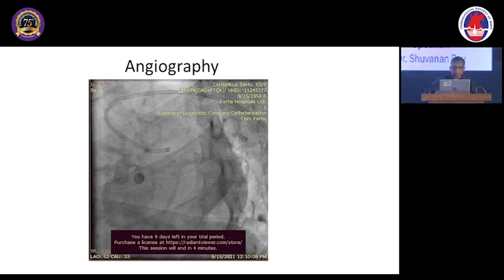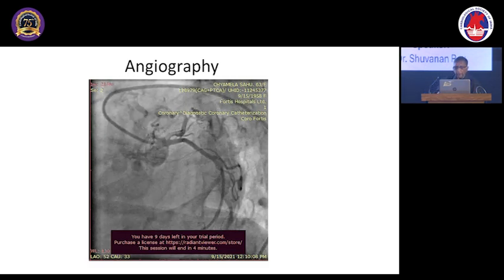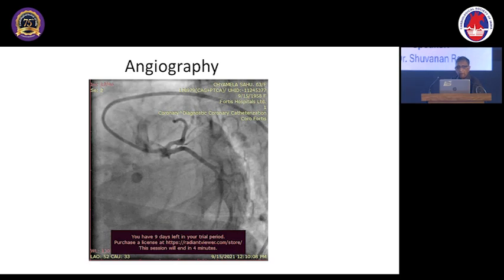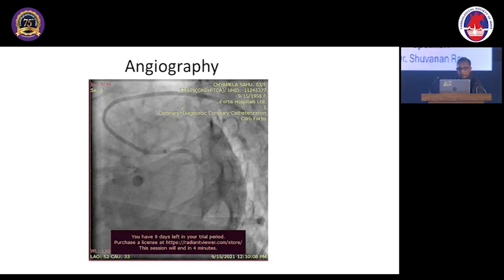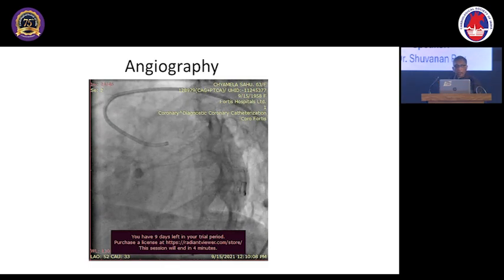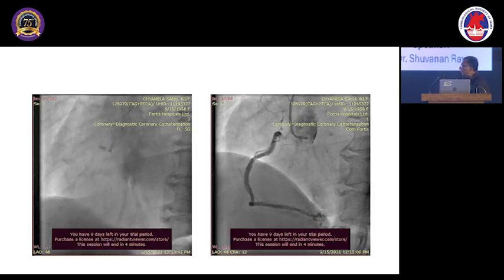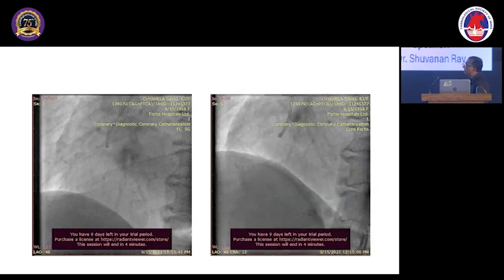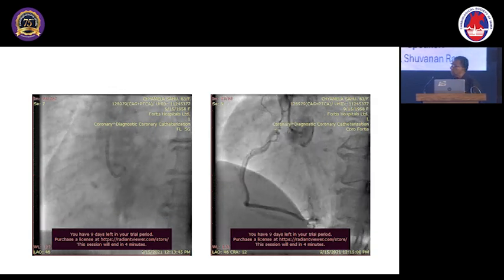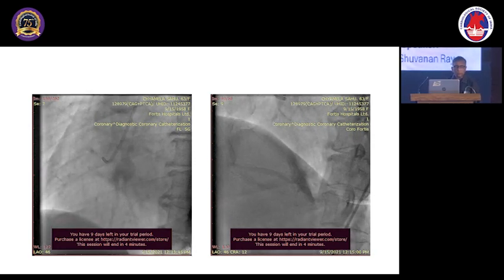Okay, and then it is the last case maybe. Again, this gentleman came with angiograms. A lady came with angina, and this is the RCA. I was in the console, looking at the hooking of the RCA. Just see this. RCA is hooked, it is normal. So people said, yes, there's nothing. And see this. What is this diagnosis?